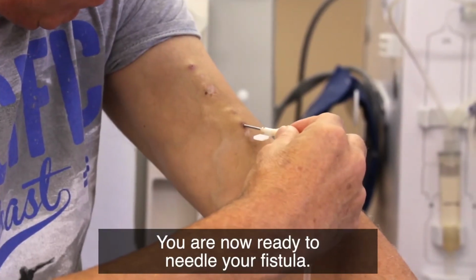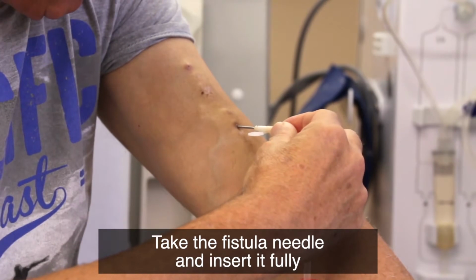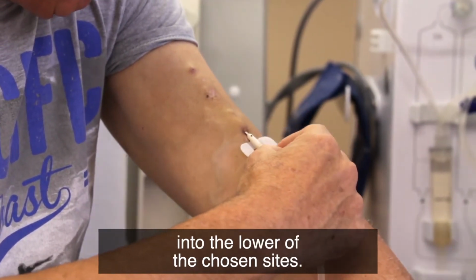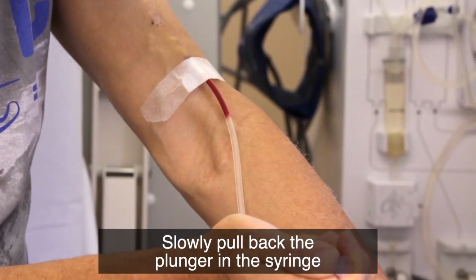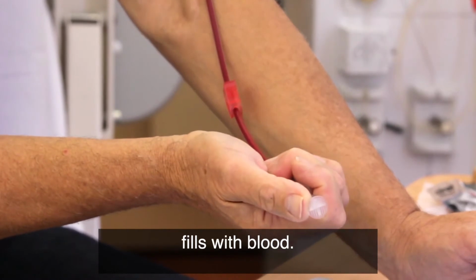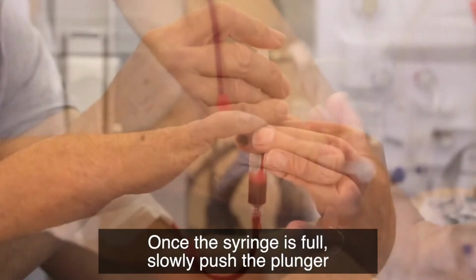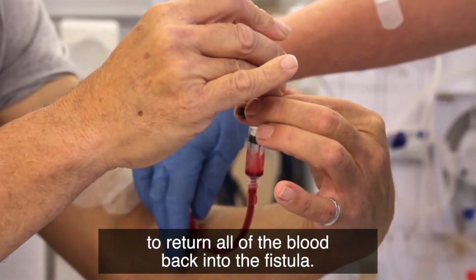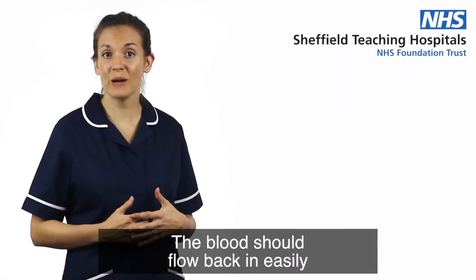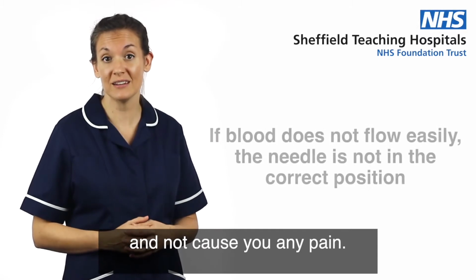You are now ready to needle your fistula. Take the fistula needle and insert it fully into the lower of the chosen sites. Slowly pull back the plunger on the syringe so that the fistula needle and the entire syringe fills with blood. Once the syringe is full, slowly push the plunger to return all of the blood back into the fistula. The blood should flow back in easily and not cause you any pain.